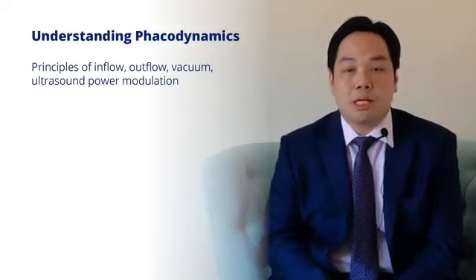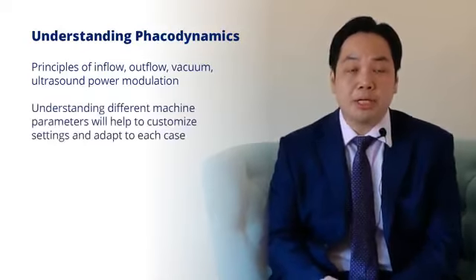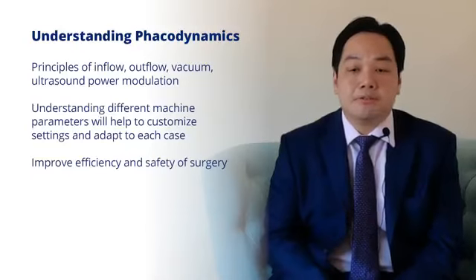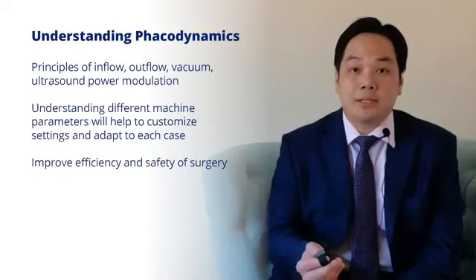outflow, vacuum, ultrasound power, and modulation. A lot of it is quite basic, but really, I think the fundamentals are crucial to understand so that we can use our machines effectively and safely. So understanding the different machine parameters really will help customize settings for us when we actually do complex cases.